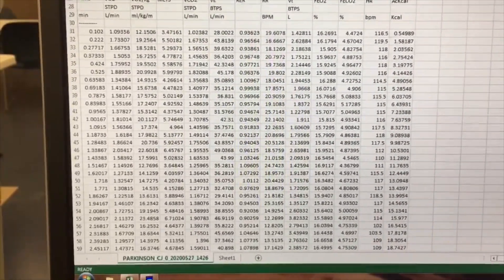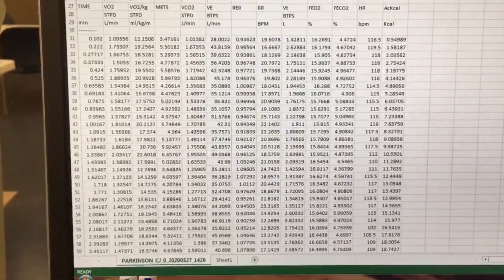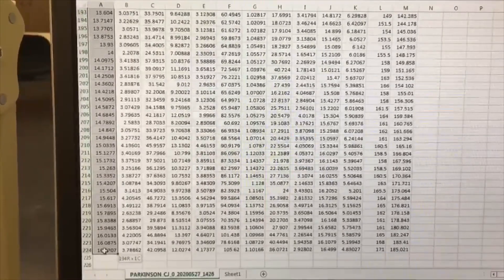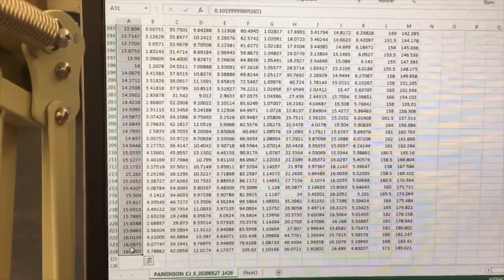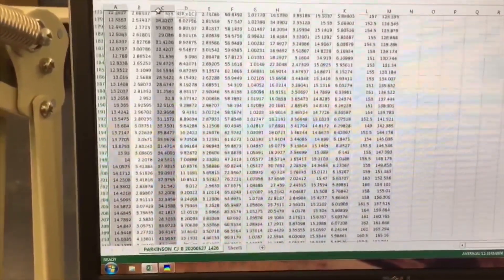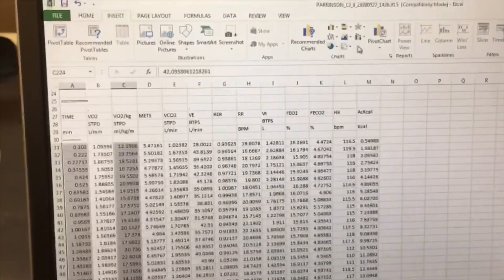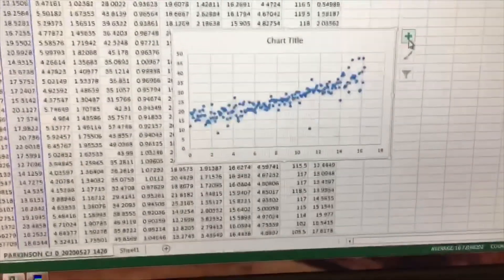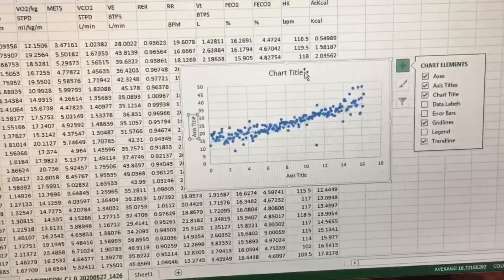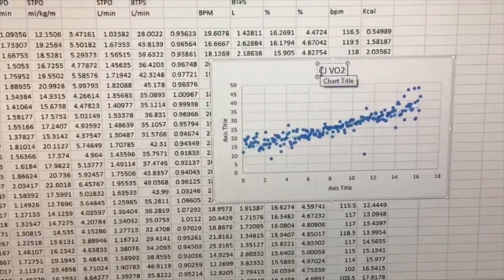Now we're going to make a graph to see whether he plateaued or not. We're going to highlight time, then hold the control button and go up to the VO2 in milliliters per kilogram per minute. The first column will be your X and the second column will be your Y. We'll do an insert scatter plot and add axes titles and a trend line. We're looking to see if that plateaus. We can label it VO2 with the bike.